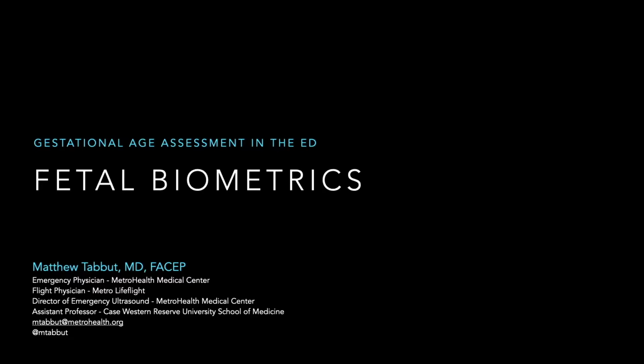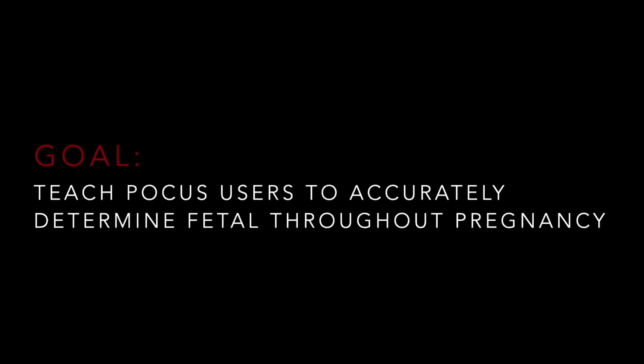All right. So fetal biometrics is the topic at hand today, and what we're going to be discussing over the course of the next little bit. It's probably not going to completely fill an hour, but it'll fill a good portion of that. So the goal, as we think through today's conversation, is we want to teach point-of-care users, whether that be emergency department providers or even other providers who may be bumping shoulders with pregnant women, how to accurately determine the fetal gestational age throughout pregnancy.